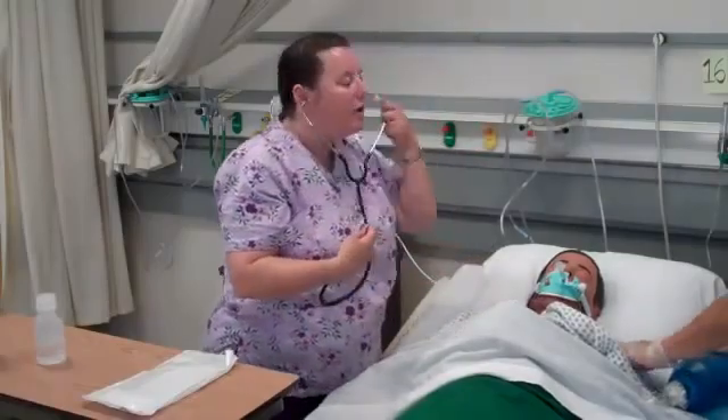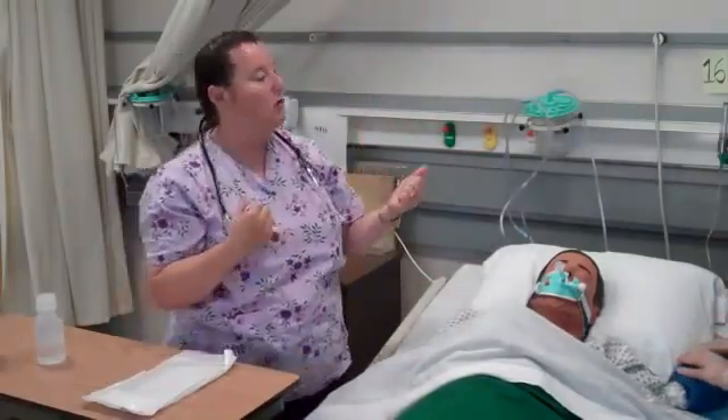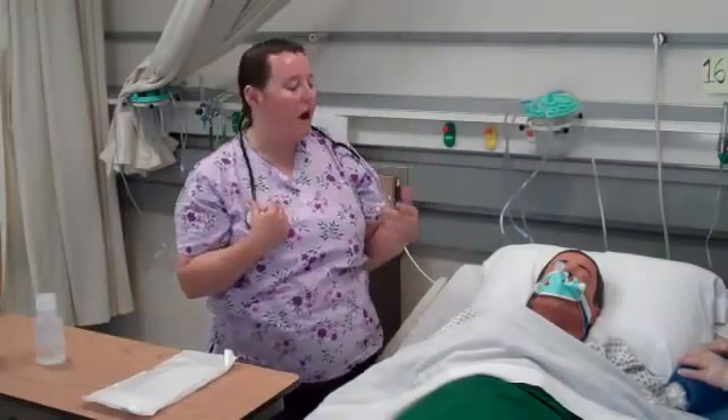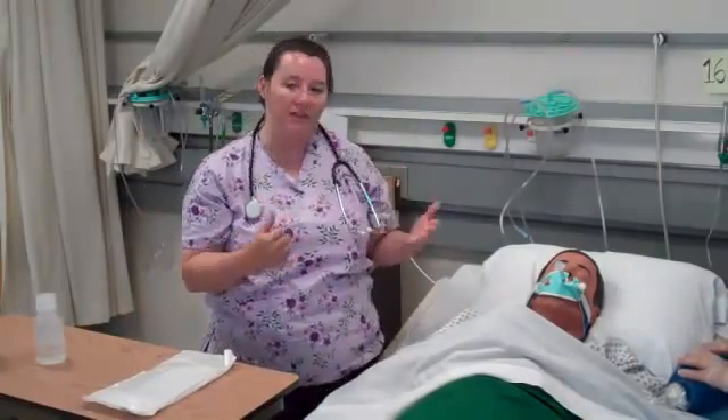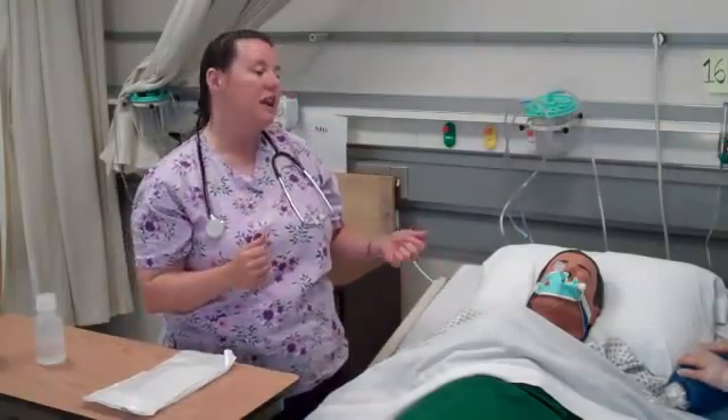I'm looking to see if what I hear compares with what I might see on the monitor — things like a low O2 sat, increased heart rate, increased respiratory rate. I might see that the patient is a little more anxious, moving about, showing some agitation.